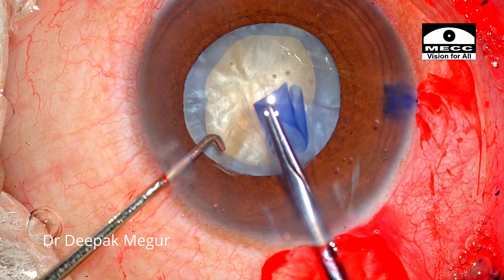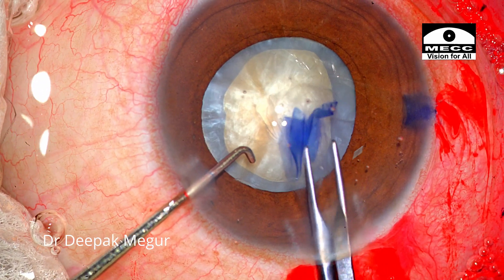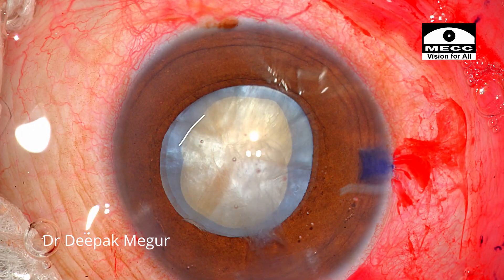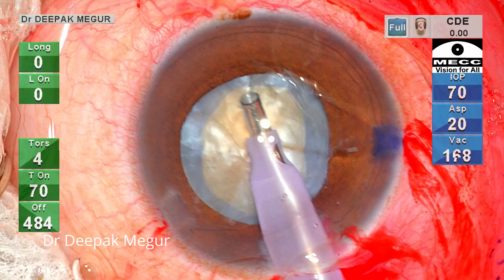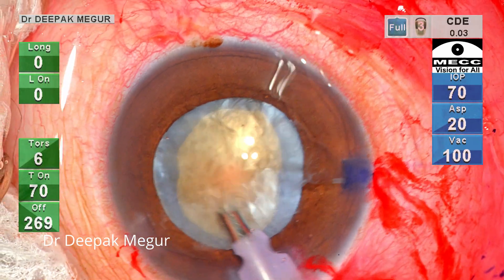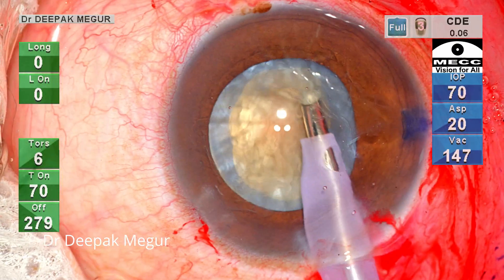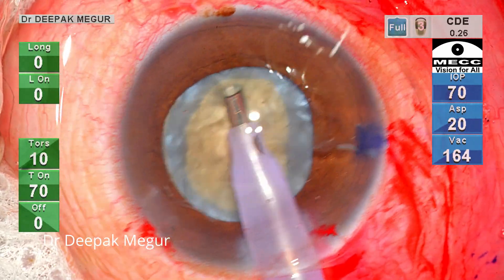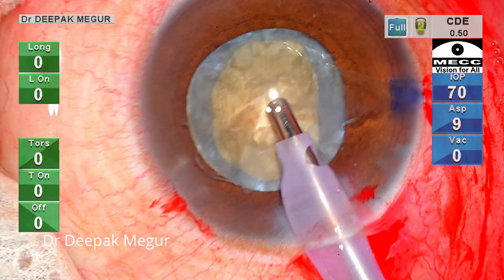The easier option would be to decompress the bag and enlarge the rhexis now and then proceed. But if we want to continue phacoemulsification with this size of rhexis, let's see what precautions we need to take. The phaco probe is introduced and the superficial epinucleus is first aspirated out. The underlying nucleus has a slight reddish-brown tinge, so we are expecting a denser nucleus. My strategy here is to first trench a little bit, get into a deeper plane, and then proceed with the vertical chop.